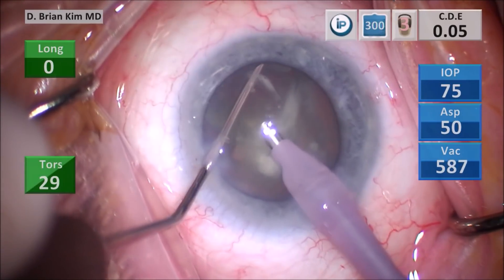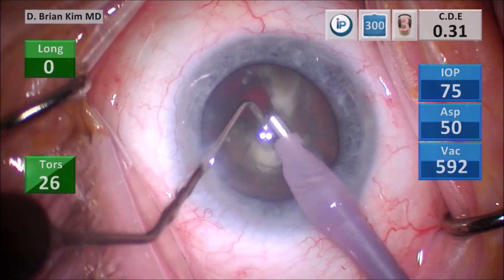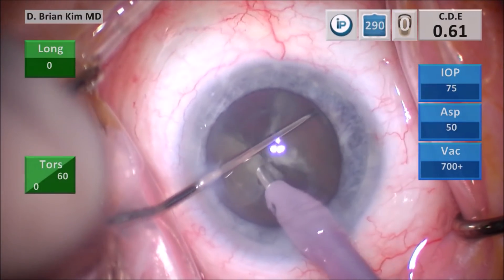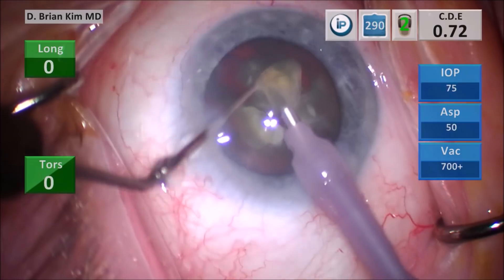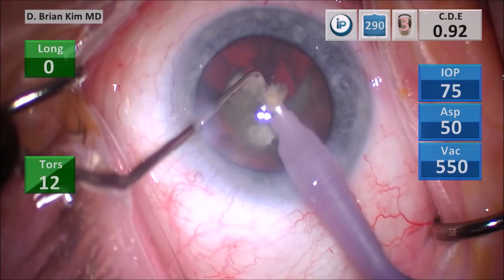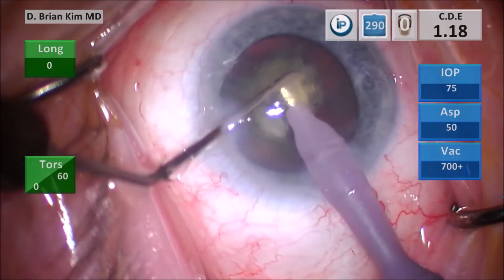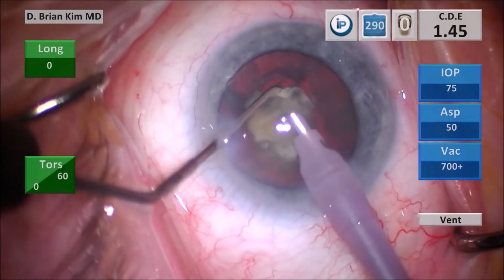Now there are three pieces. I'm taking out the first quadrant, and I am initiating vacuum and ultrasound only to emulsify the lens. I am crushing the lens material between the chopper and the phaco tip. I'm placing the chopper out and performing another cross-chop of this other quadrant, and you can see the mechanical fracturing by crushing the lens material between the instruments helps fracture the lens in half. Then I'm sandwiching the targeted lens material, crushing it, and emulsifying it once the lens pieces are in bite-sized pieces.